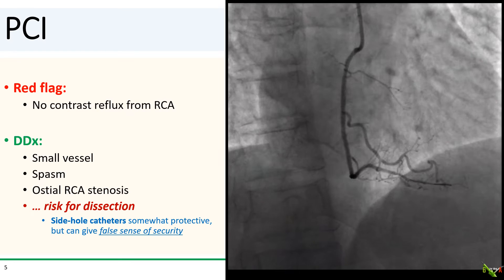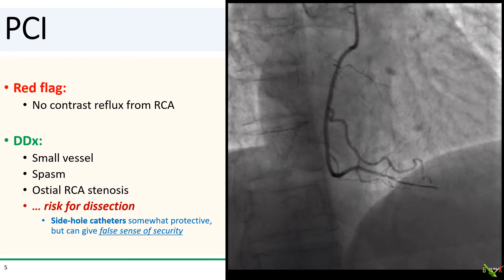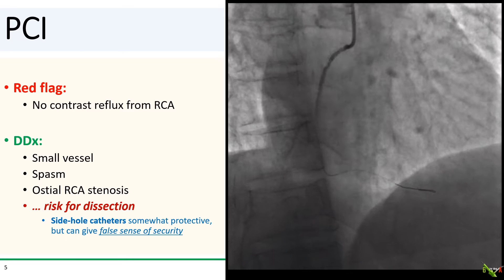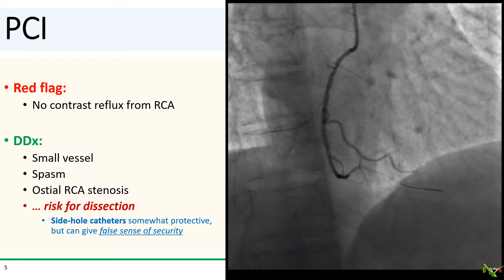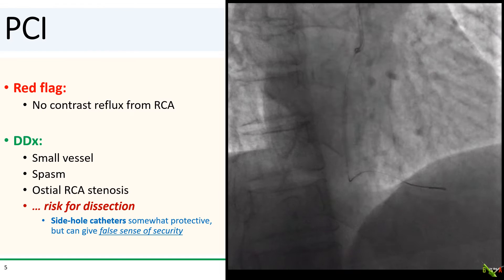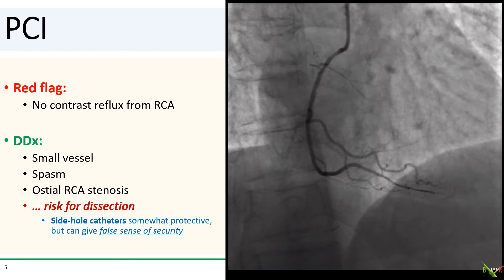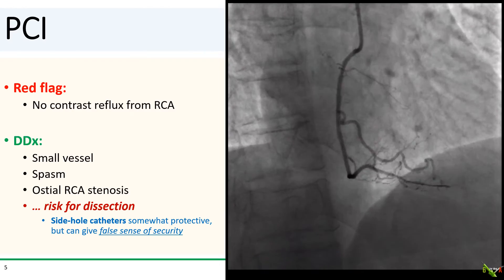I actually had the foresight to use a side hole catheter here because I thought the vessel was a little small. Side hole catheters are somewhat protective because the side holes can pop off some of the pressure of the contrast injections, but it can give you a false sense of security. And in fact, that is exactly what happened here — on the next fluoro, we noticed a small dissection right at the tip of the guide in the proximal RCA close to the ostium.